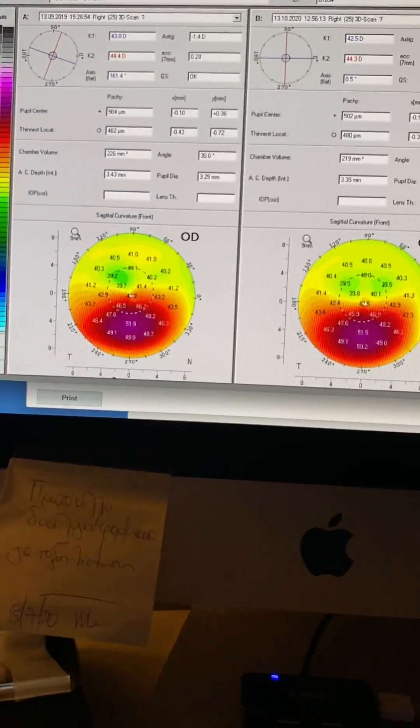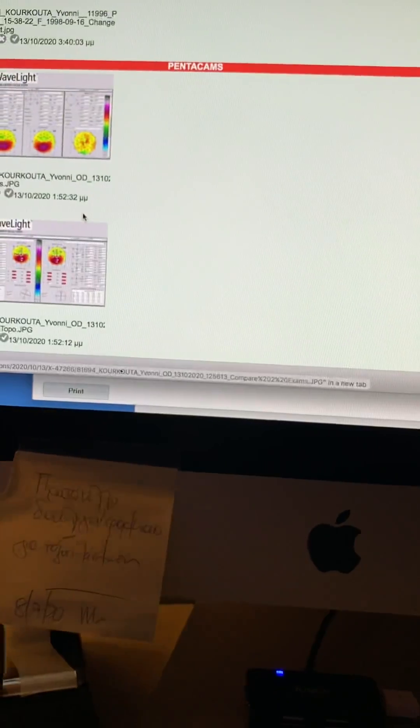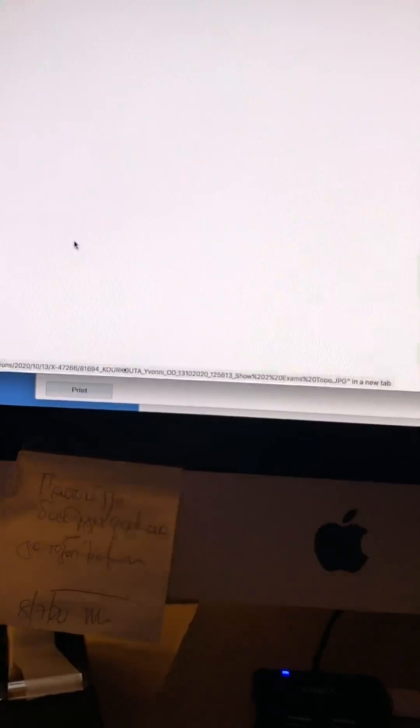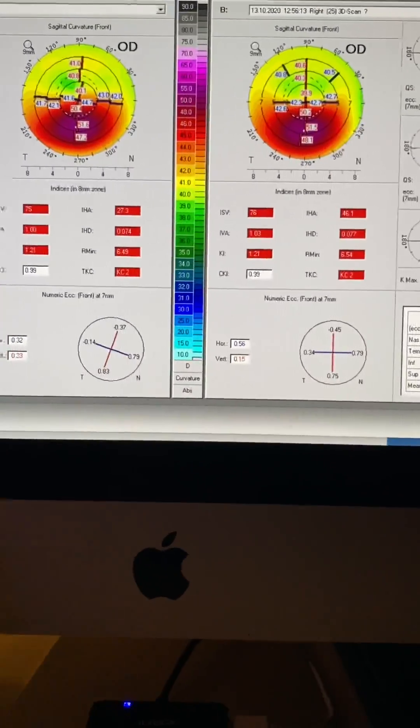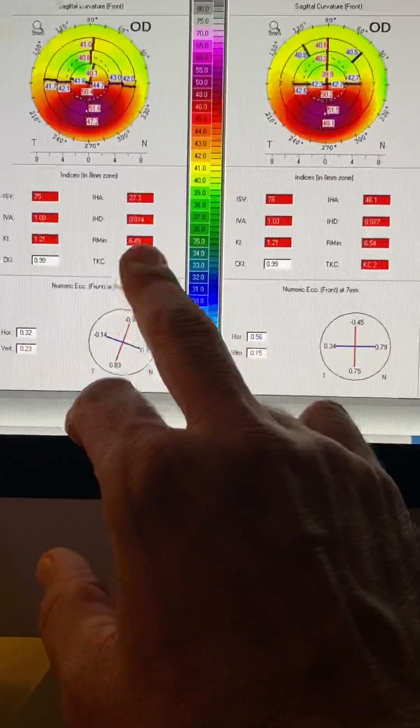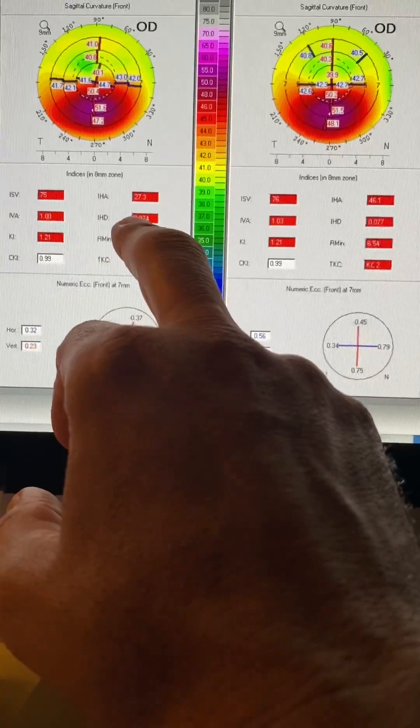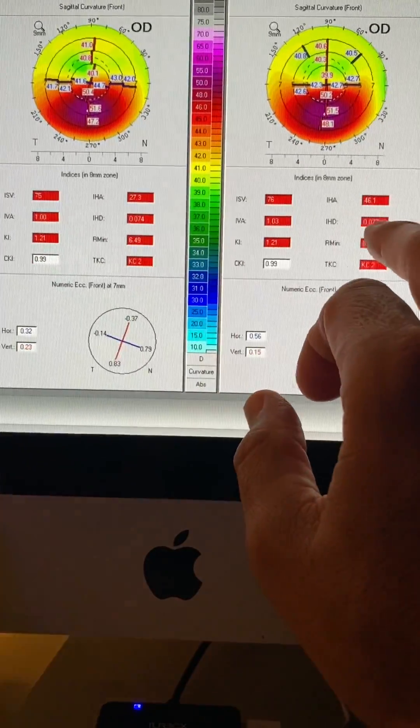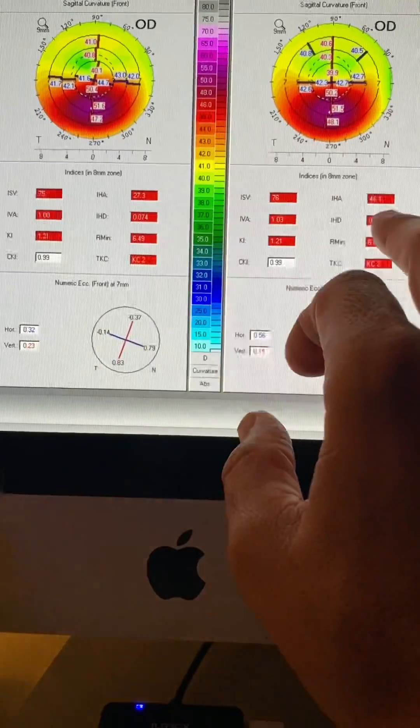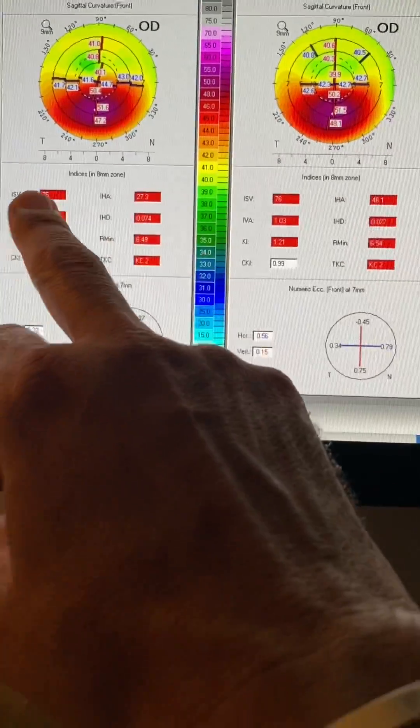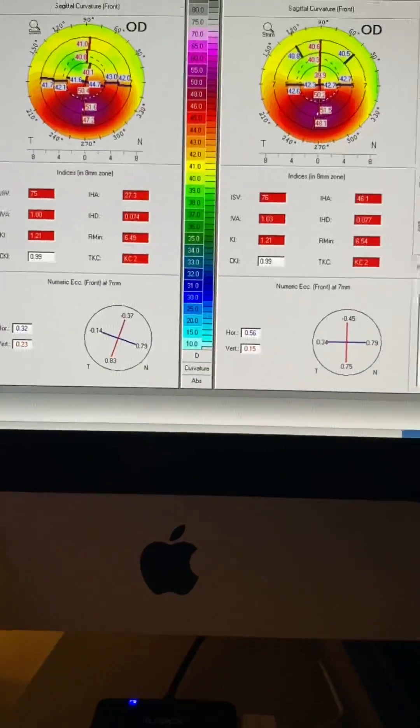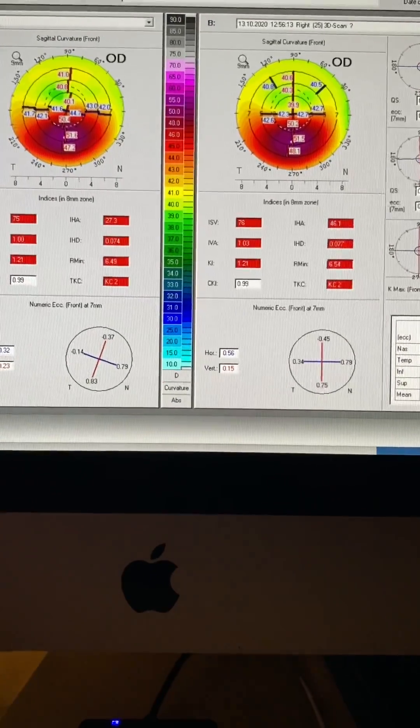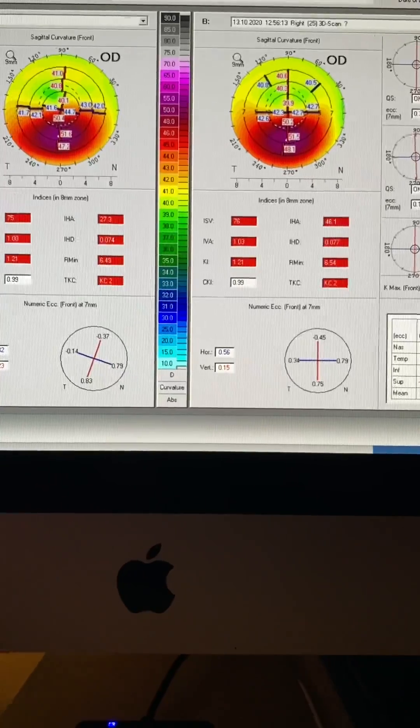We'll look at the topometric indices for the right eye as well. And IHD 74, 77, a very slight difference, ISV 75, 76. So we should advise this young lady that her keratoconus is stable.